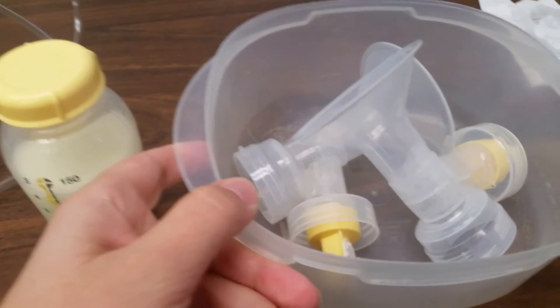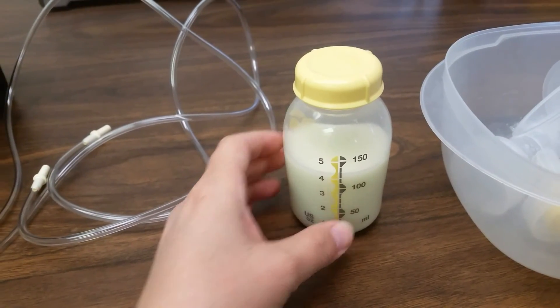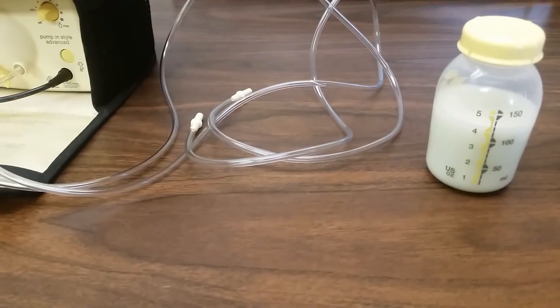Pump parts are ready to be washed. Milk is ready to go in the fridge or freezer. Thank you.